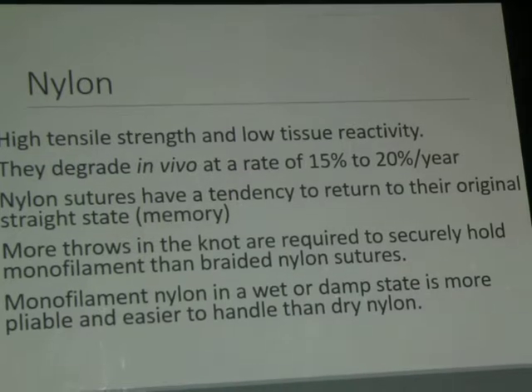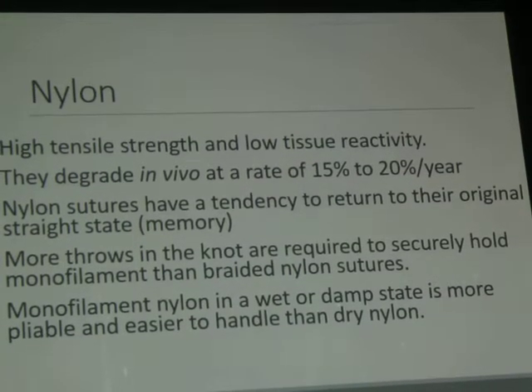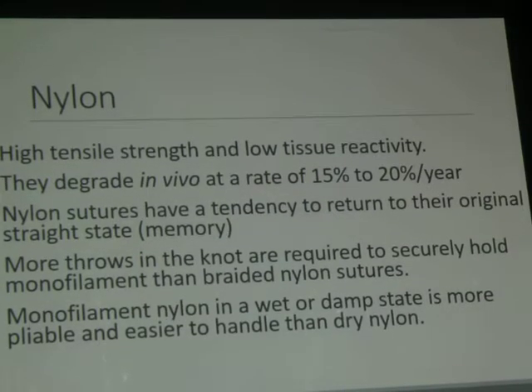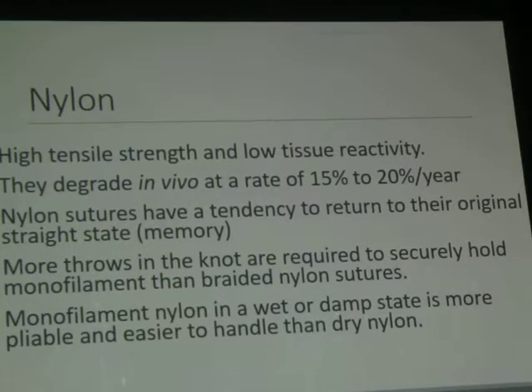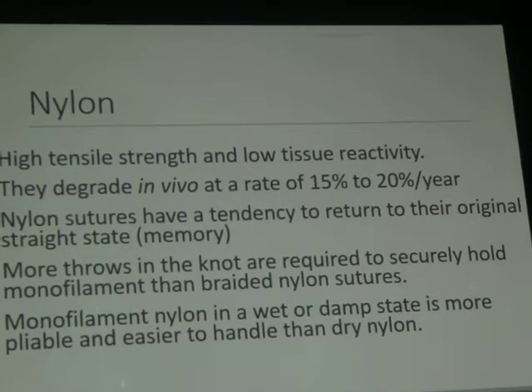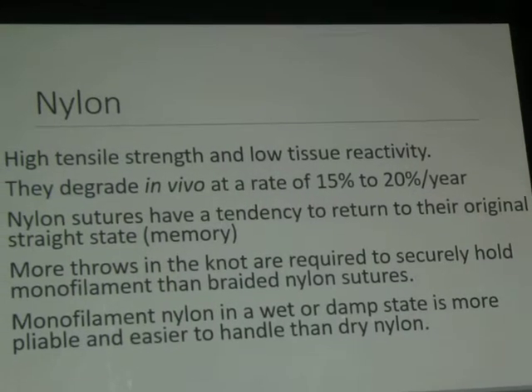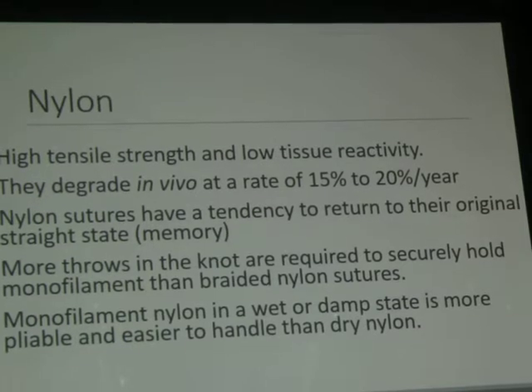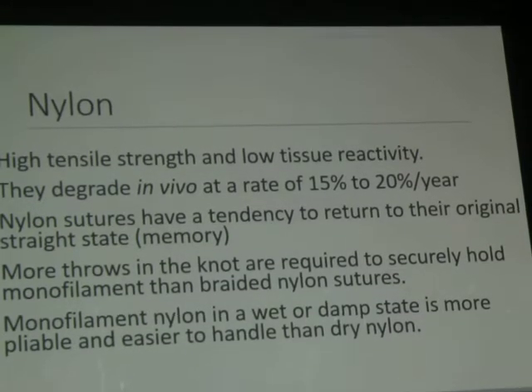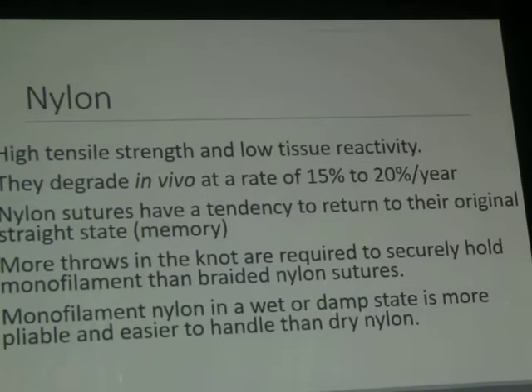So when you take a nylon suture out of the pack, the first thing you should do is to break this memory. How to break this memory? We hold the thread, straighten it, and put a small stretch on it, without cutting it, just to break the polymer memory. Now we can use the suture. If you take the suture out of the pack and use it directly, you are bound to have a very loose knot. This is a very important point.